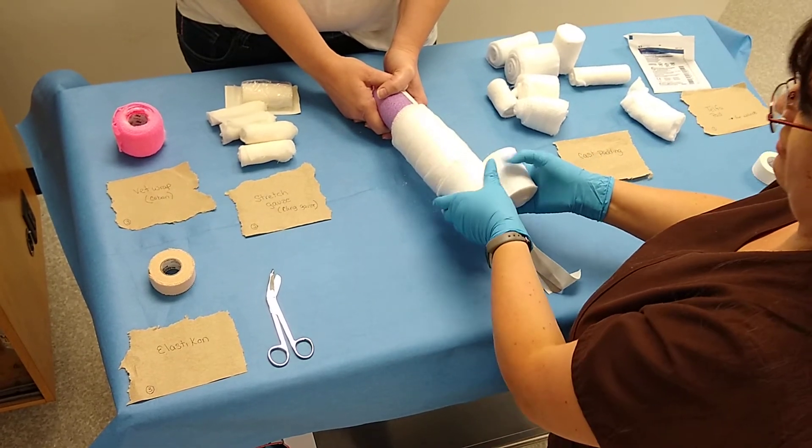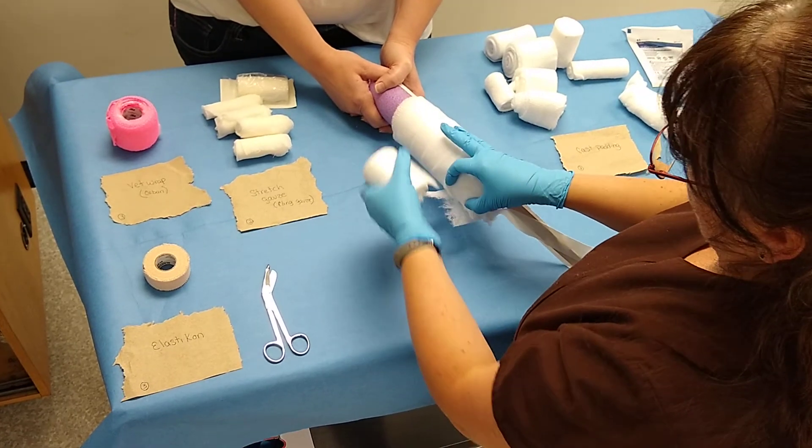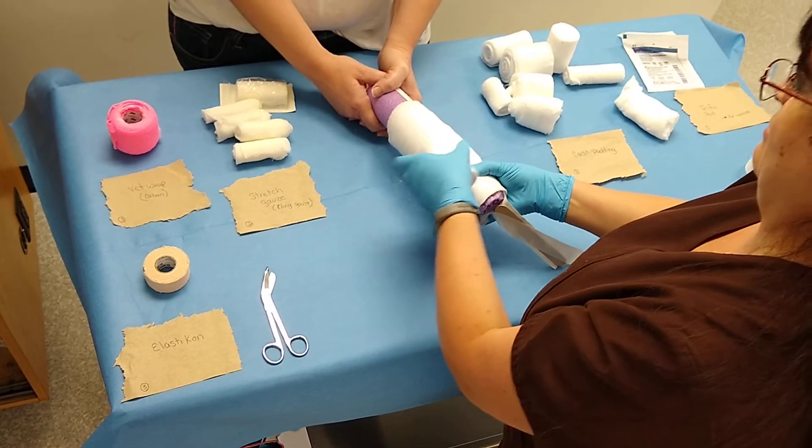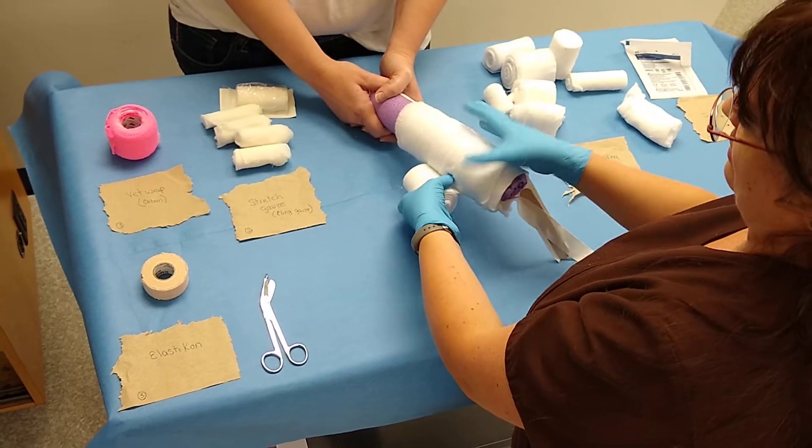You still want your toes exposed because you're going to be assessing your toes for swelling, wetness, and heat.